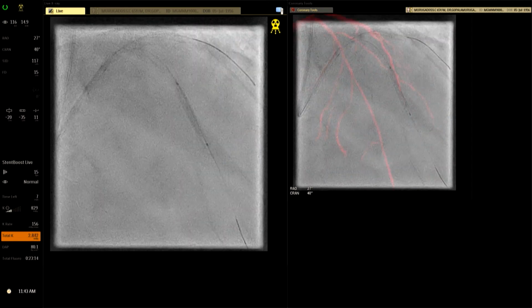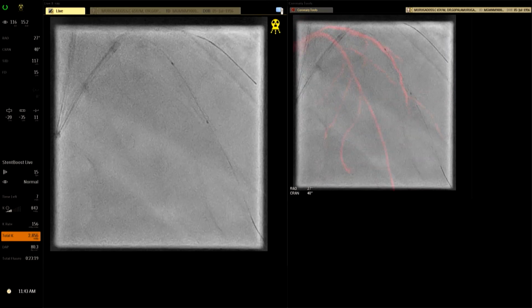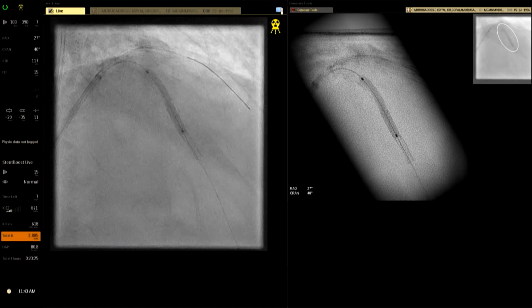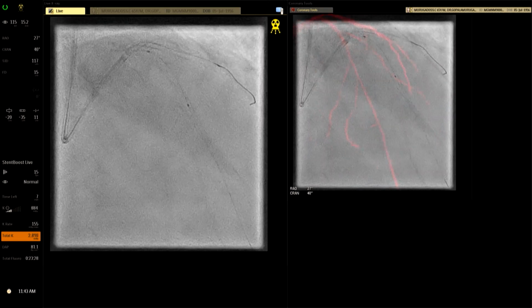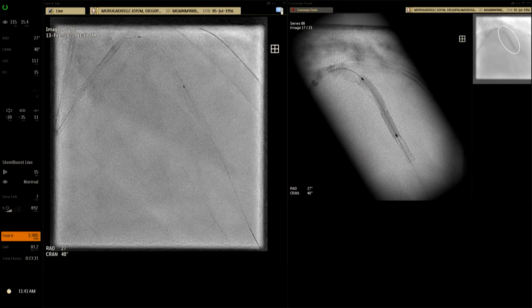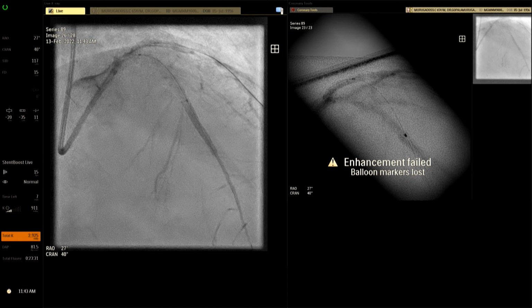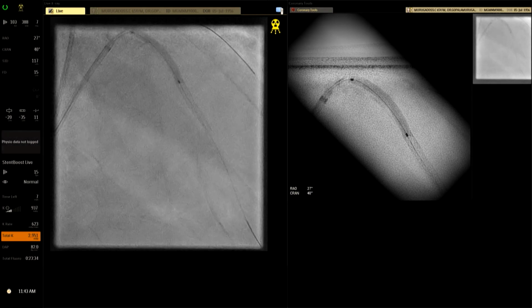Okay, down. Okay, go up. 18, sir. 18. Okay, down. So we're just going to do a sizing shot with this, just to decide what size we need. Okay, go up. So this is a 22. I'm at 18, sir. 18, 20. Down.